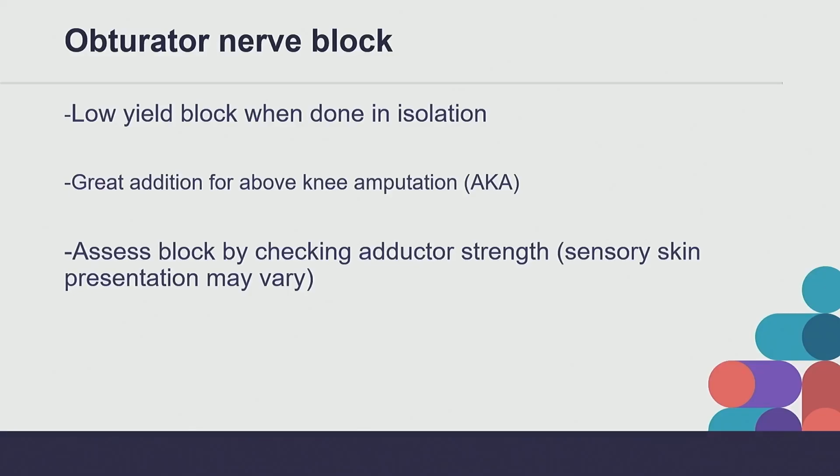It's a great addition for things like above the knee amputation, again, because you do need to not only get that femoral and sciatic, but that lateral femoral cutaneous and the obturator to get the medial part of the thigh.